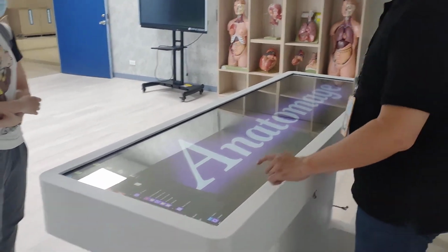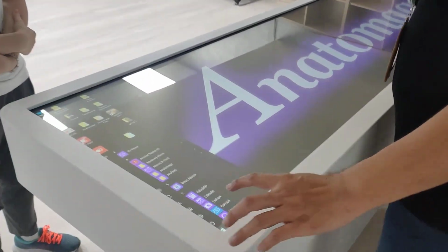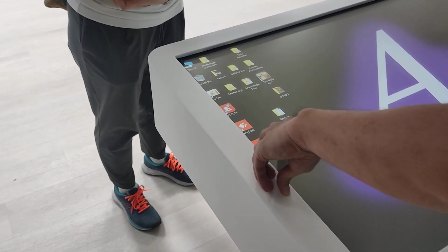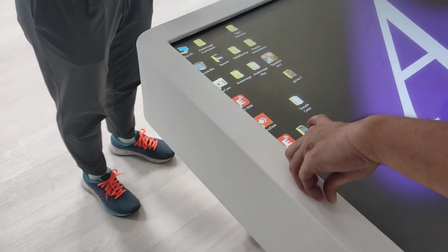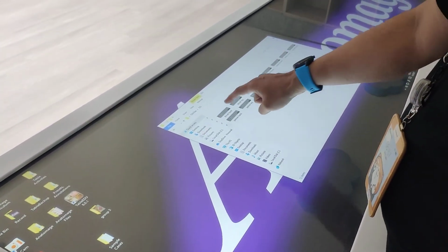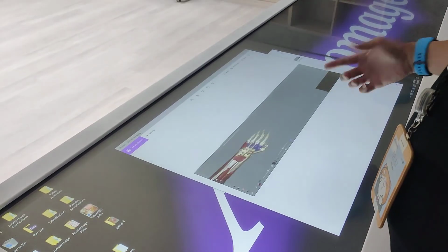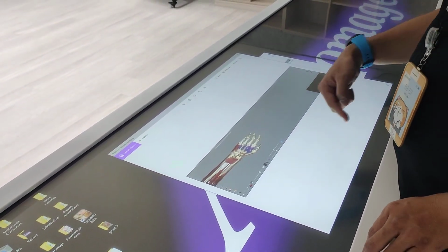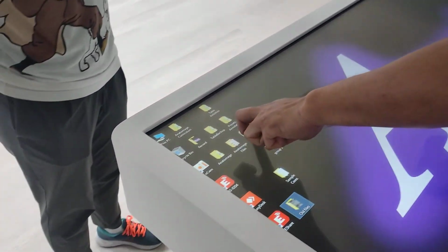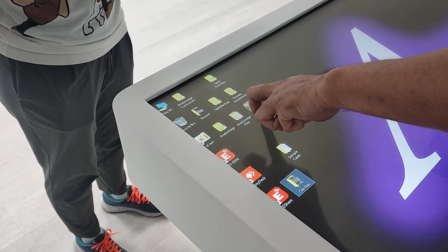All right. I put some of the old files in this folder. So if you want to see what people did previously, you can simply go in and find something. Okay, this is what they did previously. All right, and this is the 8F that you need to turn on.